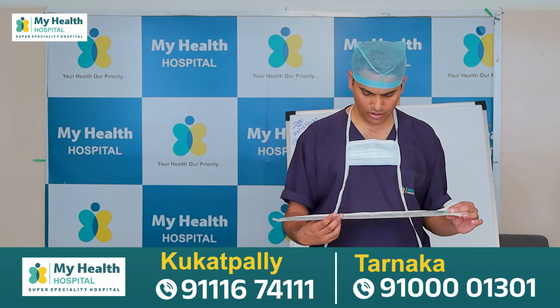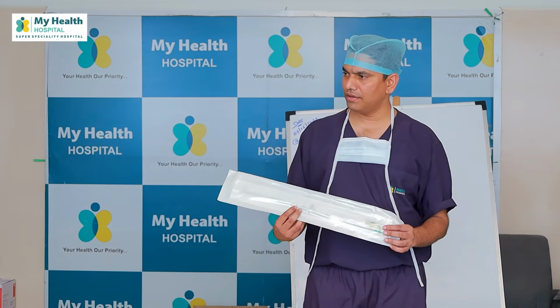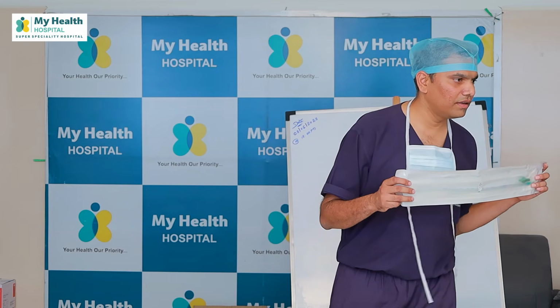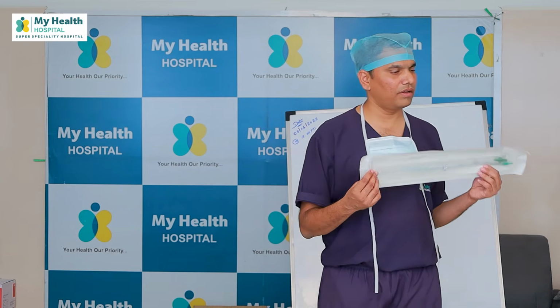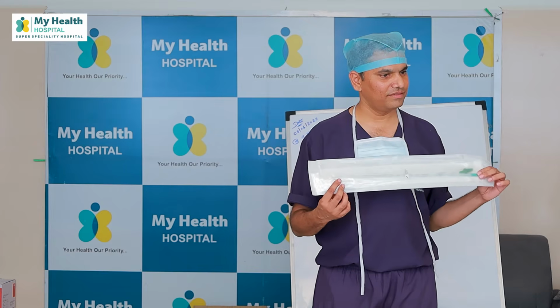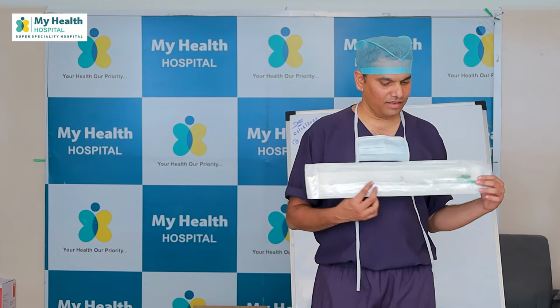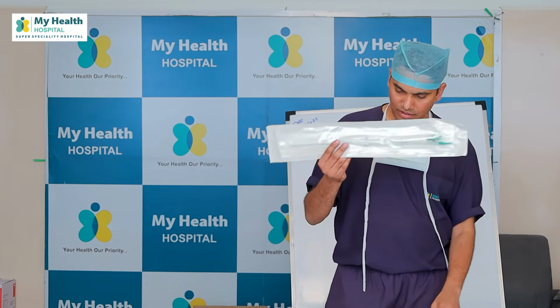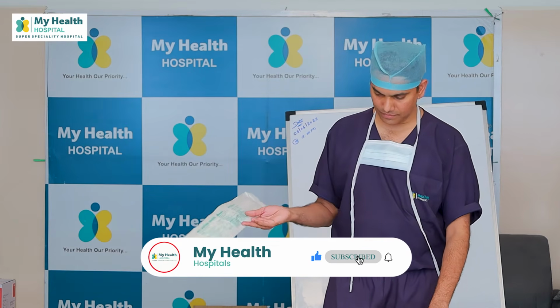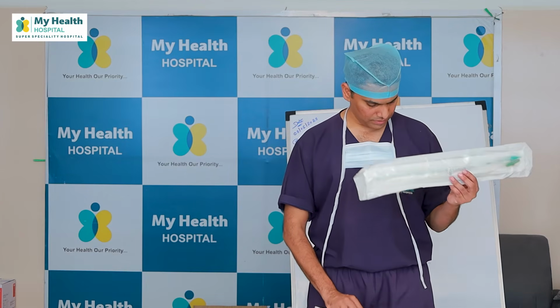Okay. How do you know this is ICD? What is this? How do you know? This one, its cousin, what is it? Take it as a drain. So what is this?